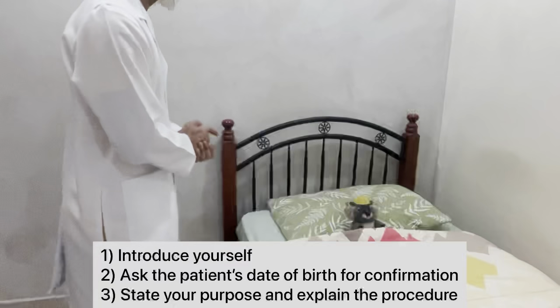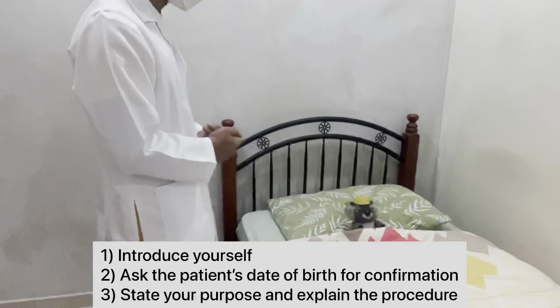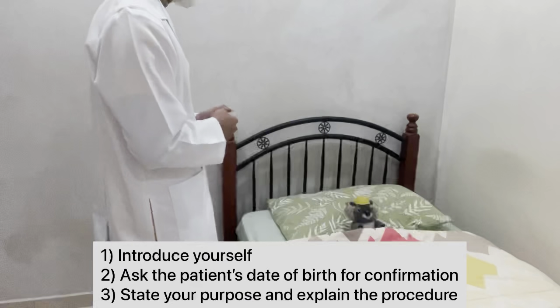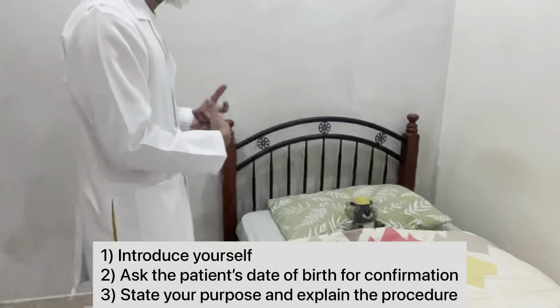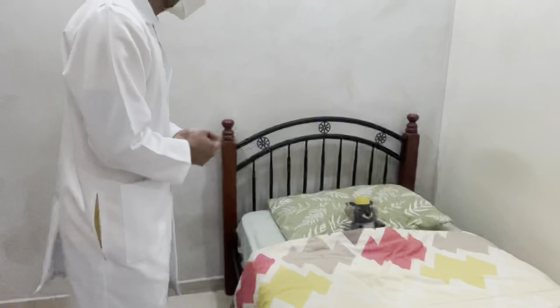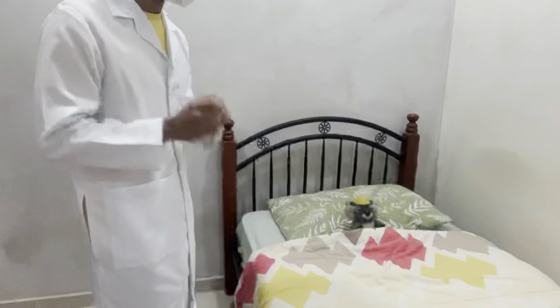Hi, good morning, Madam Melissa. My name is Nasywan. Can you tell me your birthday first and foremost? 29th of August. Alright. So, Madam Melissa, I just want to tell you that I came here because I want to perform a catheter. I want to care and insert a catheter for you. So, do you need any time to prepare? You don't need. Alright. So, wait for a moment. I'll go back and take all the necessary equipment.